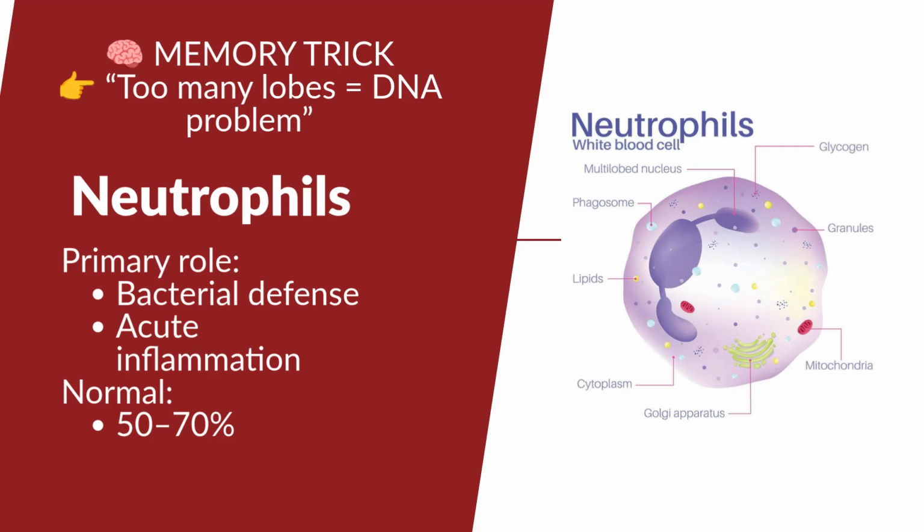All right, primary granules, secondary granules. These granules contain enzymes that destroy bacteria. Neutrophils in the manual differential: when identifying neutrophils, look for a segmented nucleus, pale cytoplasm, fine granules, and clumped chromatin. Neutrophils versus bands: try not to confuse bands with segmented neutrophils.